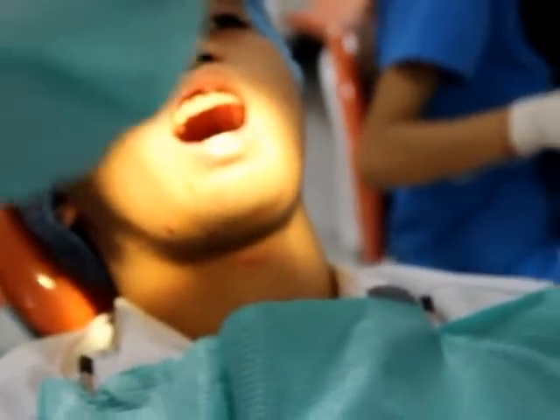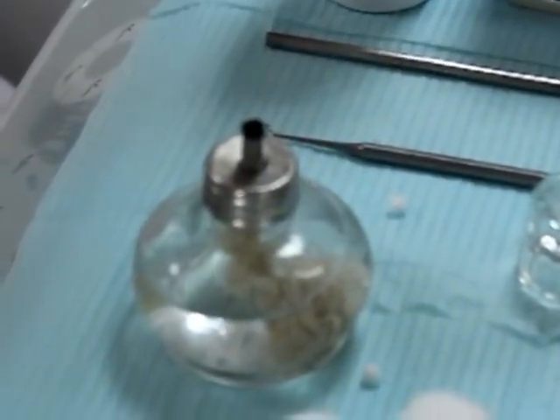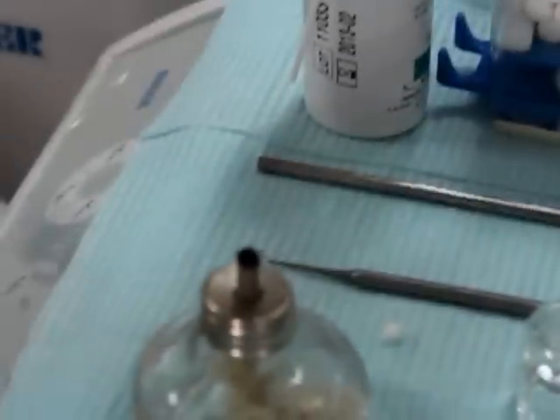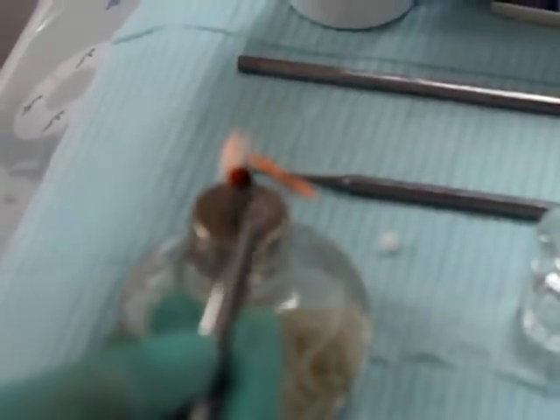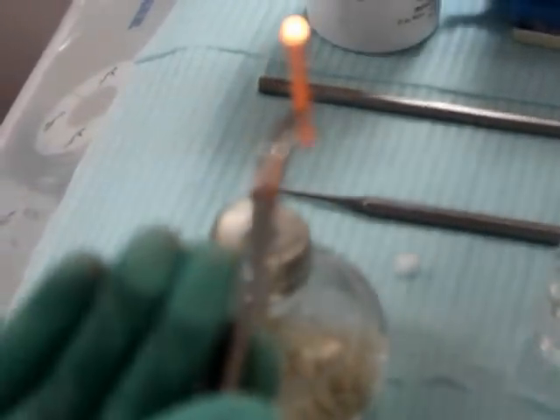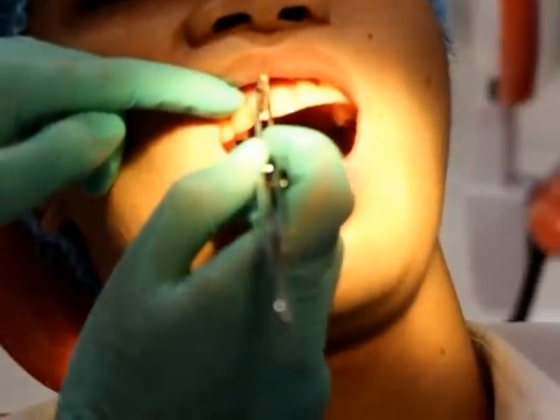Okay, and then this is how to heat the gutta-percha. Now I'll make a Christmas tree. Hanging up. Okay, heat it. Fix the edges. Oh, it's burned. That's how it is. And the contralateral.